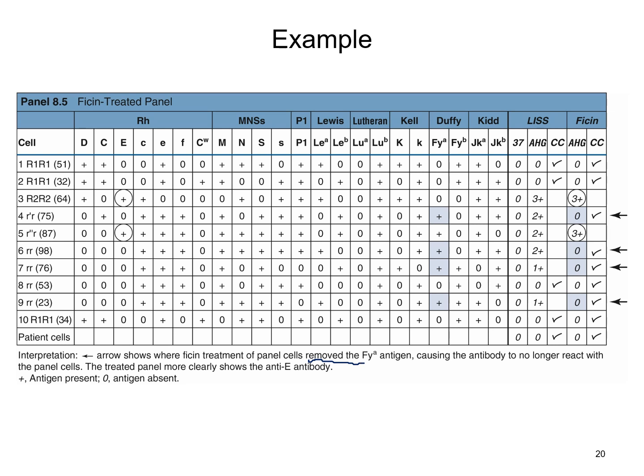So for this particular panel, what happened is first they ran it like normal. So they ran it with that LIS enhancement. You don't see your immediate spin reactions here. We're going to assume that they were negative. I'm thinking the book just saved space with this panel here.